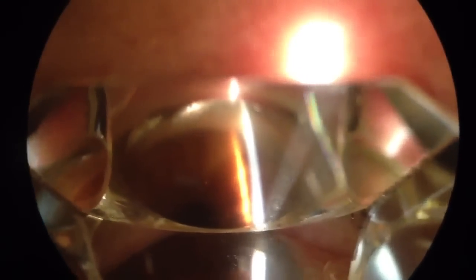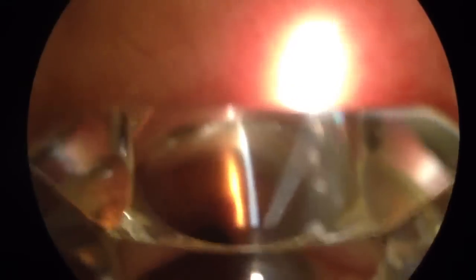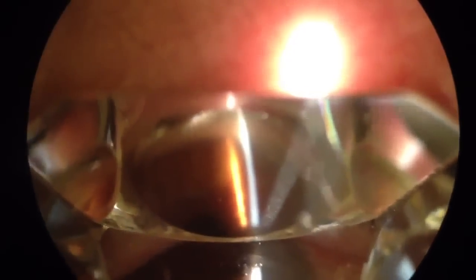Currently, we're looking through one of the mirrors of the gonioscopic lens as it sits on the eye. If your eye doctor measures high pressure of the eye, make sure that he or she performs a gonioscopic examination.